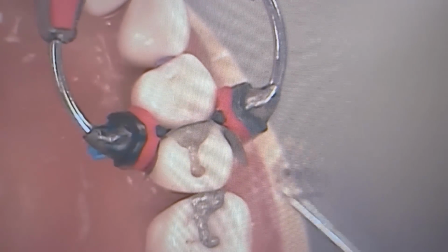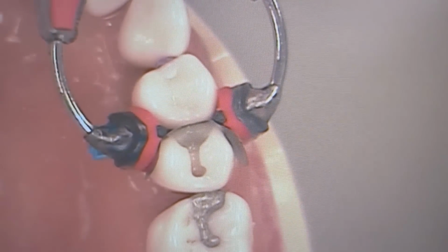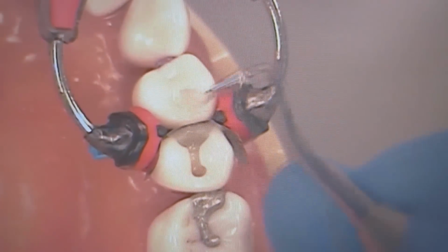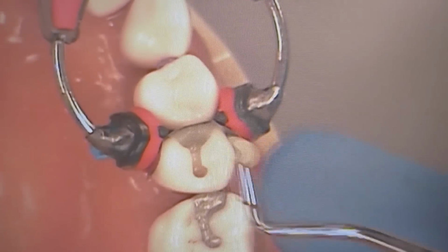I'm going to start to build up the... So with this composite, the preparation is so tiny that I'm going to do my best to build up the buccal first. In this case, I'm going to build up the buccal first.